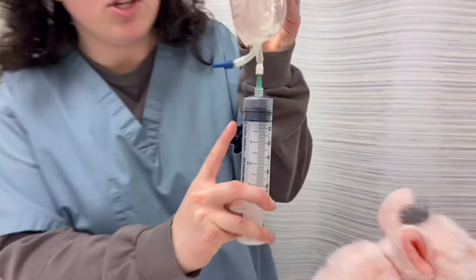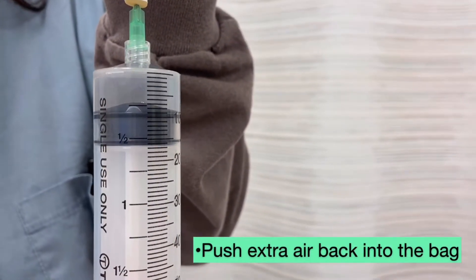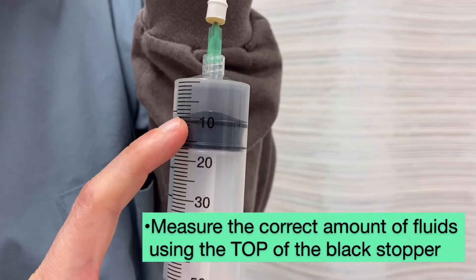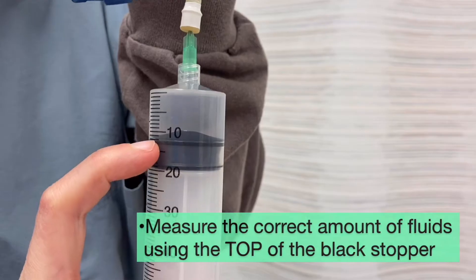You can see that sometimes air will still get into the top. No worries, just gently push the plunger back in to put all the air back into the bag. You'll want to draw back enough fluids so that you have enough for whatever amount you'll be giving to your pet, to the top of the black stopper.